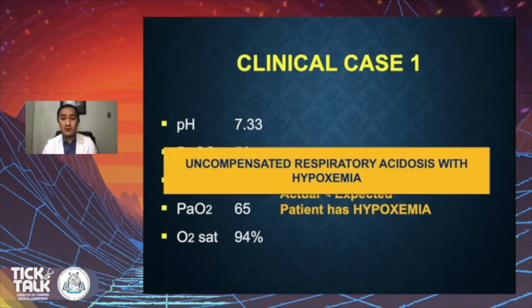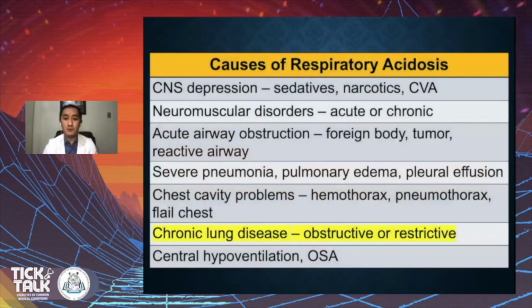So the full interpretation is uncompensated respiratory acidosis with hypoxemia.